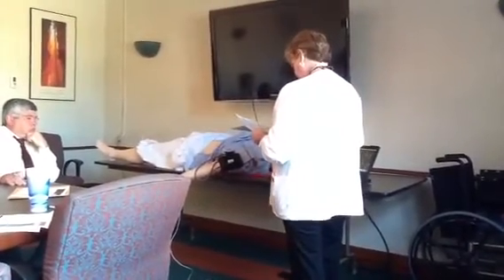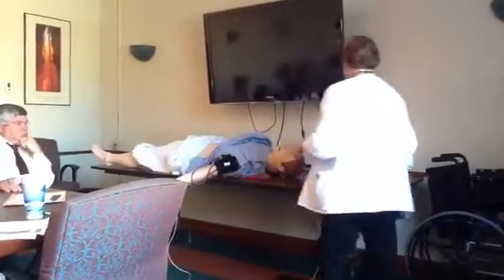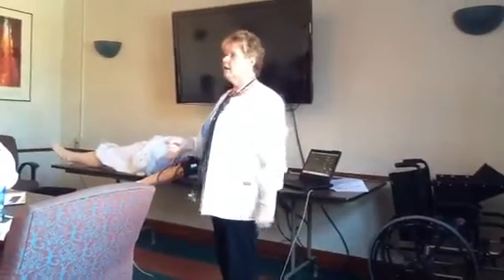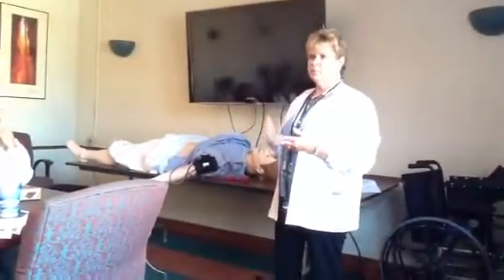He also came with a camera, so we have a camera that comes with him, I didn't bring it down. And it records whatever you're doing, so when you're doing a simulation with students, you can record it and then look at it after the fact and say, maybe you should have done this, or did you do this? And they'll say, oh yeah, I did that. Let's look here and see if you really did it. So it is a good learning tool. It's not punitive, it's to learn, really, more than anything.